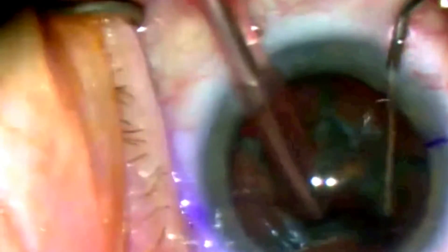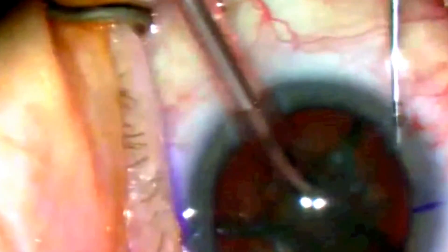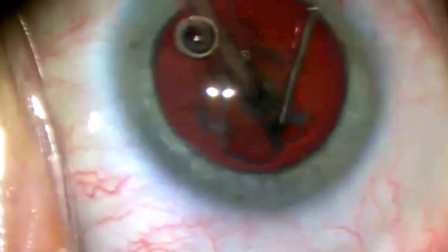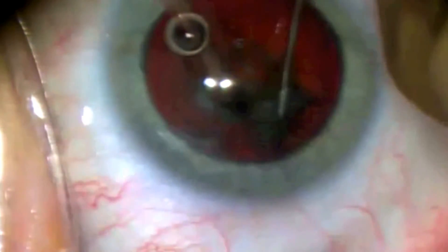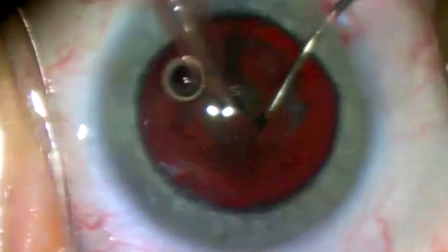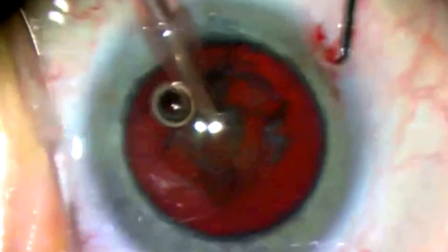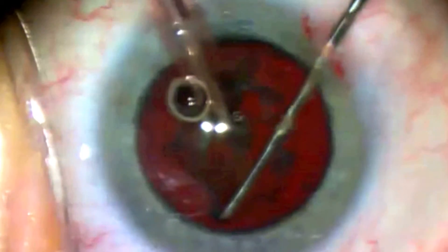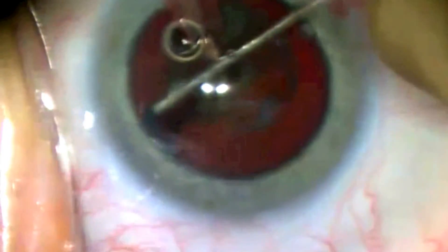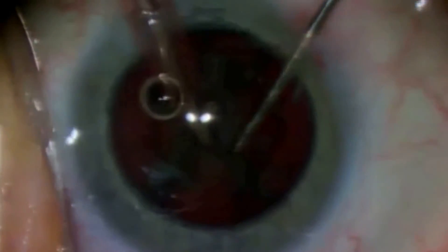We'll do one last chop, spearing the lens and pulling them apart, and we are now down to five pieces — easy to remove at this point. In our last case here, we'll show a failed vertical chop. We push the chopper down and try to split, making several attempts; we're actually able to crack the lens anteriorly into two pieces but it doesn't crack all the way through the posterior plate. At this point I'll abandon the chopping and switch out the vertical chopper for a Dodick horizontal chopper, then down the same direction as the initial failed chop, I'll hook the nucleus. Since you already have a partial chop, it splits easily, and I finish this case by chopping the rest of the nucleus with the horizontal chopping technique. This shows you can do other ways if the chop fails initially.